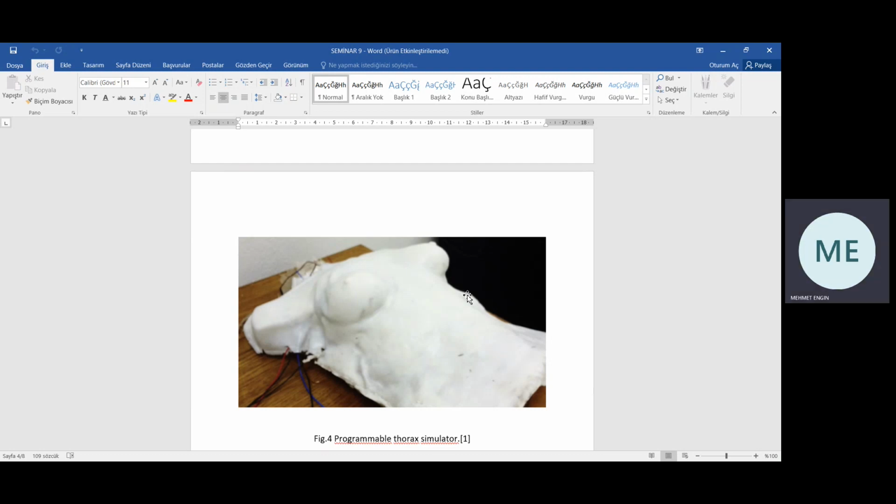The thermal performance of the hydrogel and silicon blend representing human skin was experimentally analyzed. The actuators corresponding to tumor size tissue were placed 3 centimeters deep in the center of the upper quadrants of both breasts, because this is statistically the most common area of breast pathologies. Once the actuators inside the hydrogel were supplied with energy, they produced heat, and during heat production, thermal images were taken to analyze the temperature response.